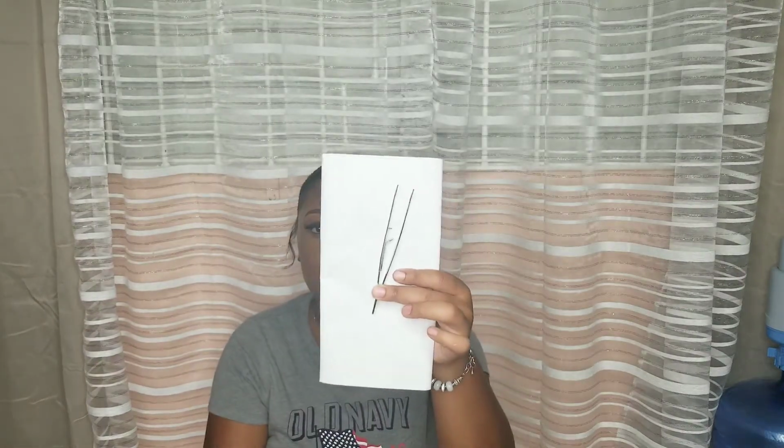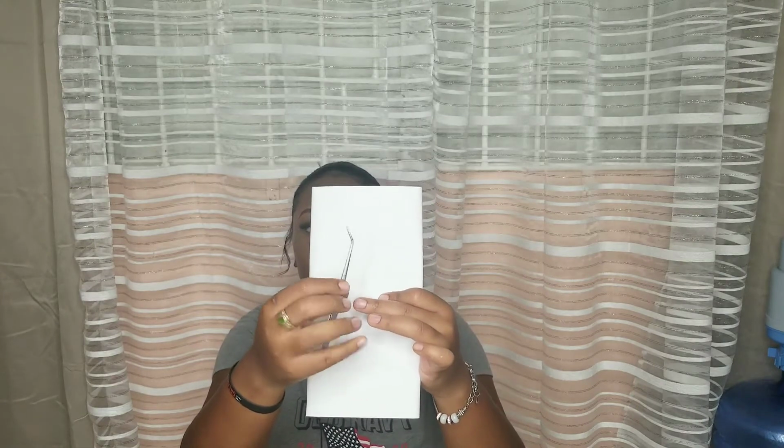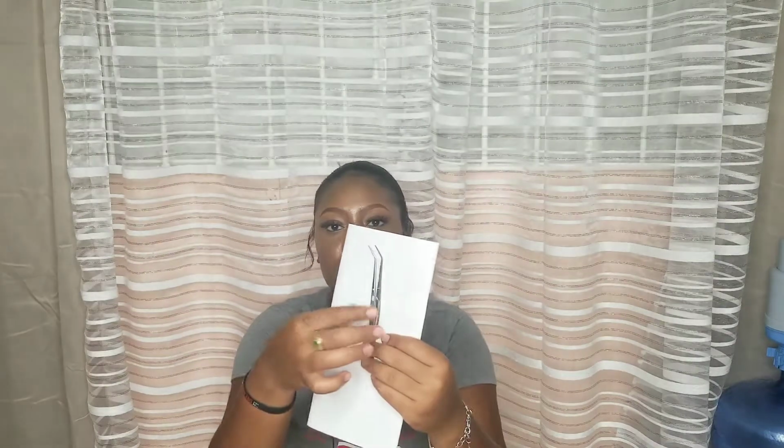Okay guys, so before we jump into the instruments that you'll need for filling, another thing that you're going to need is a cotton pliers. So this is what it looks like. This one has a latch on it, so you see it locks in place, but there are some that don't have this lock. This one is used for endodontics, while the others are used in every other procedure. I'm not sure if it matters which one we have.